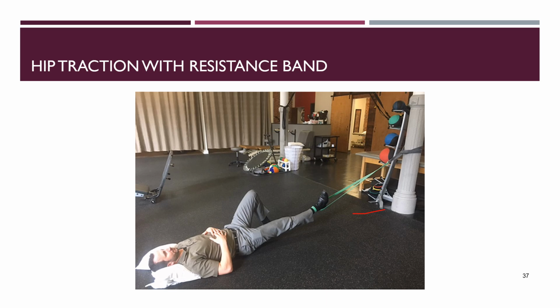So there's a lot of different setups that you can use, but you can see here a really thick, strong TheraBand, or they call this like a pull-up assist band. You can utilize this and educate your patients on the use of something like this at home to maybe help with their hip pain and to get long axis distraction all the way up to the lumbar spine.